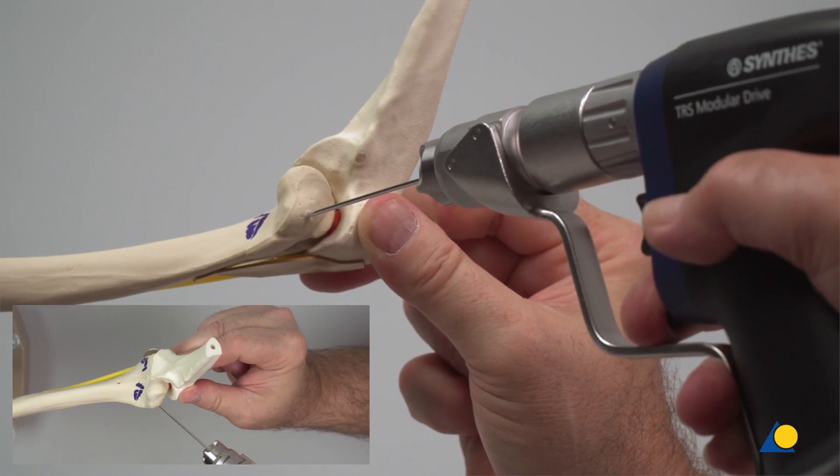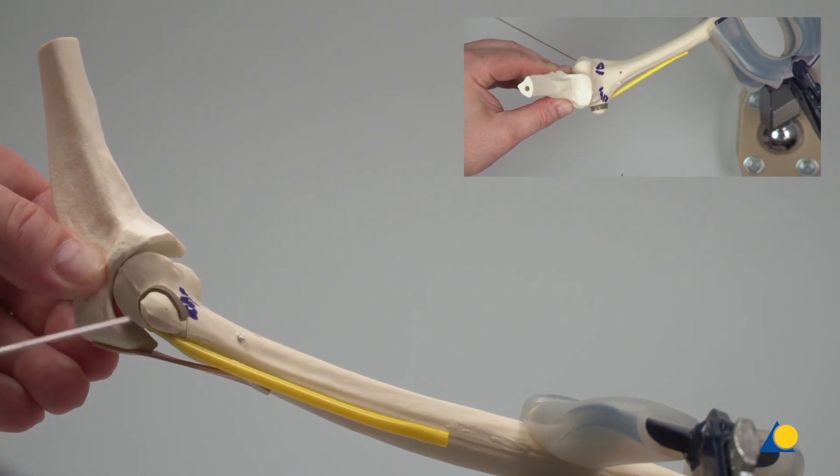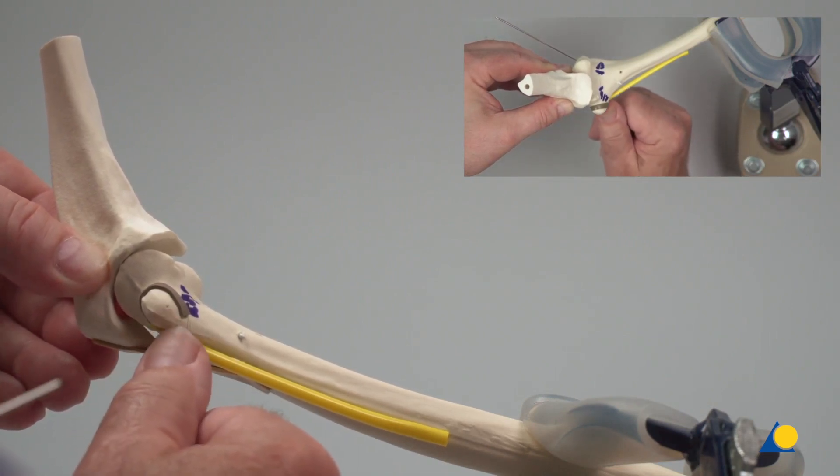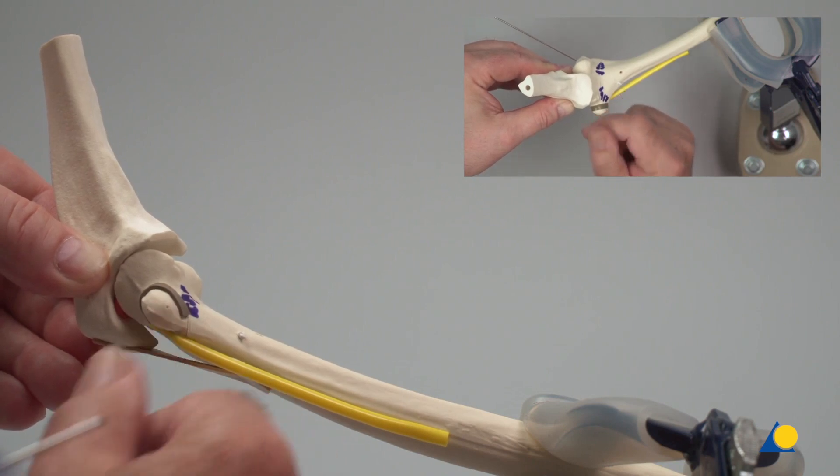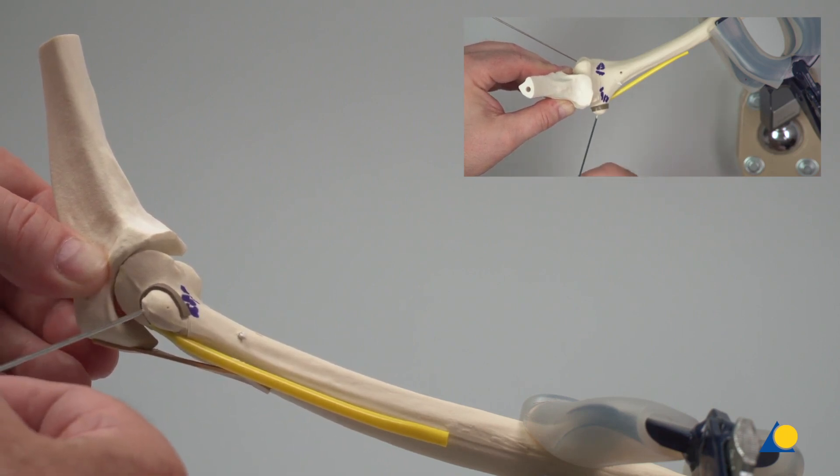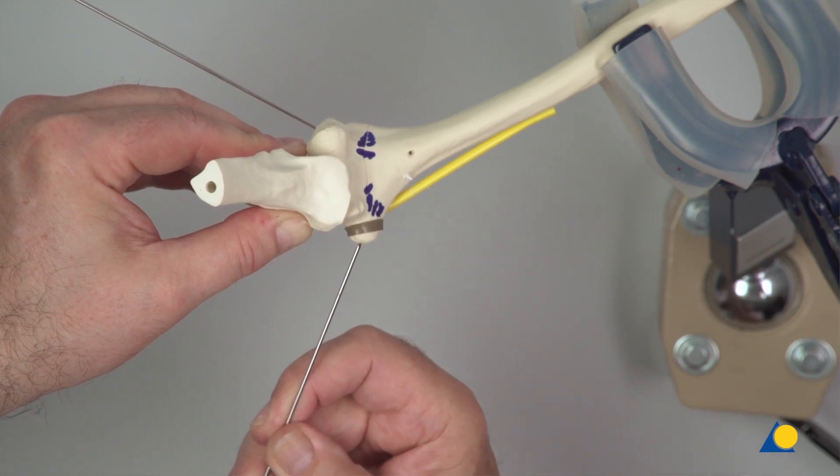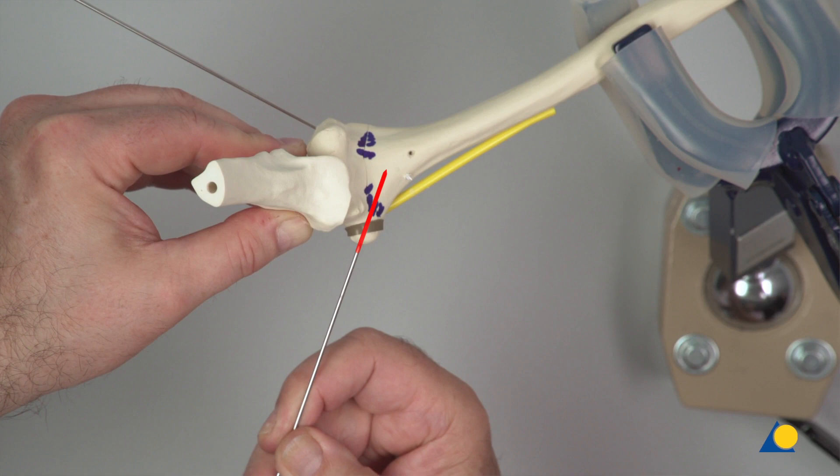The bone model is rotated 180 degrees to visualize the medial approach. In the clinical situation, the K-wire entry point on the ulnar side is located by palpation of the medial epicondyle or with intraoperative imaging. If swelling prevents palpation, a small stab incision is made. The K-wire is placed directly on the epicondyle and supported by hand before being drilled in the direction of the humerus shaft axis.